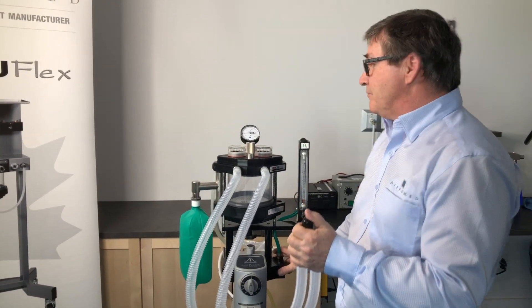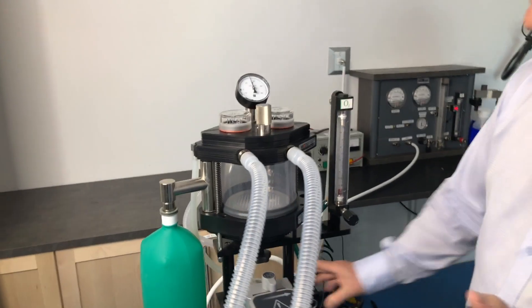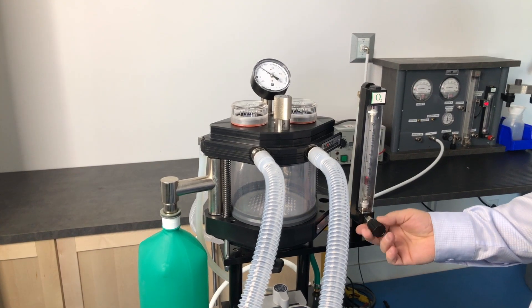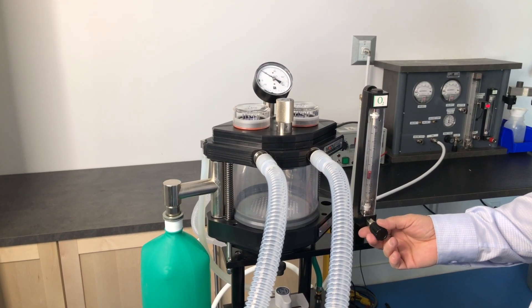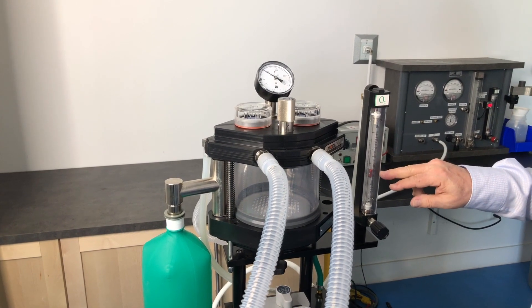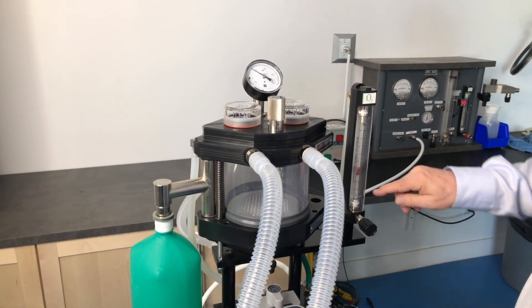Now, if we have a leak, observe the gauge — it's dropping. What you do is increase the flow on your flow meter until it stops dropping, or just slightly increases. At that point, where the needle is stabilized, that's the quantity of leakage that we have.